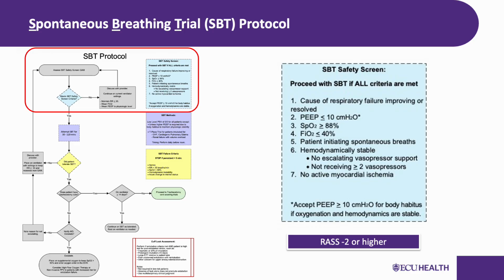You're communicating and coordinating with the bedside nurse to ensure the patient's ready and sedation's been addressed and the time is appropriate. Then you proceed together with the SBT. Now, here's a critical piece I want to emphasize, and it ties directly to the ABCDEF bundle.